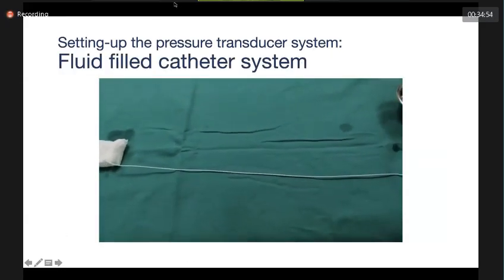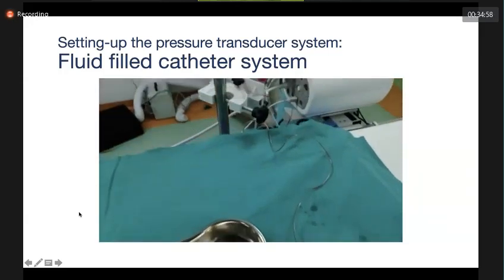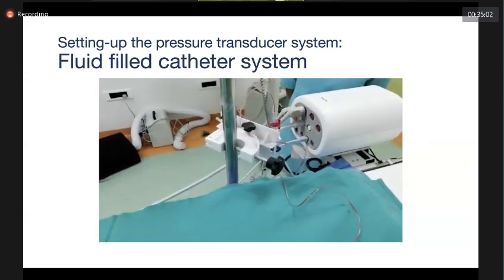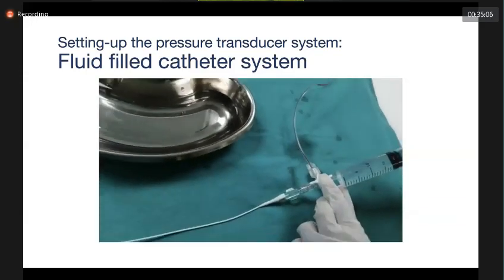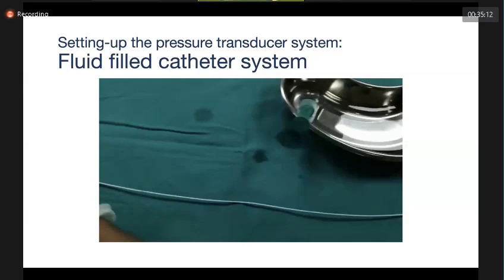Then the fluid-filled catheter system. When you ask your nurse or fellow, he will give the catheter just like that. That is absolutely wrong. The catheter will have air in it. Suppose I ask you to flush the catheter, what you people are doing is just flushing the catheter, leaving the three-way open and giving it. That is again a wrong method.